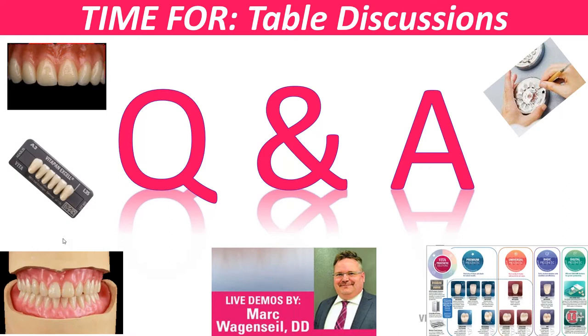The long branch rugae is typically right behind the incisive papilla. It's the first rugae right behind the incisive papilla, and you're looking for it to end just as the arch starts to turn where the canines would be. That's typically from a visual perspective where you're looking for it.